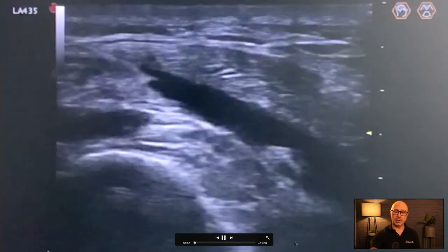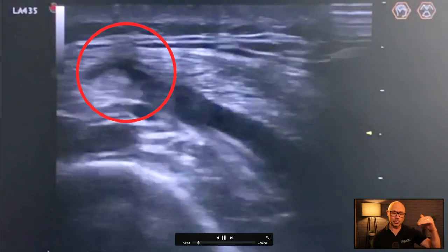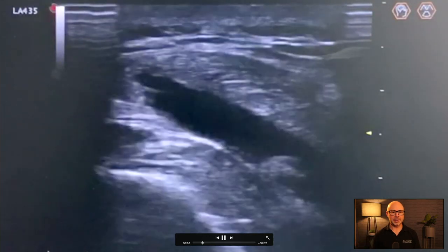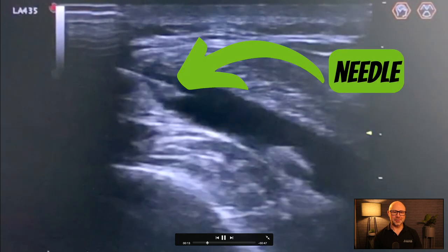The needle comes in from the left hand side of the screen, coming down at an angle. I think I'm around the other side — yes, it's coming down this way. You can see it coming in from the left hand side of the screen, down at an angle.